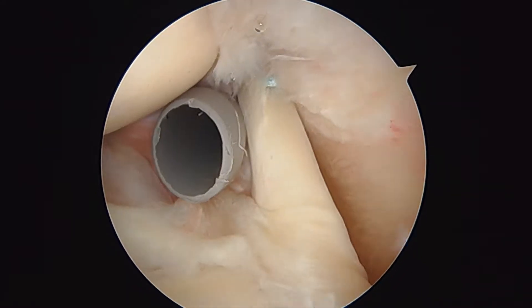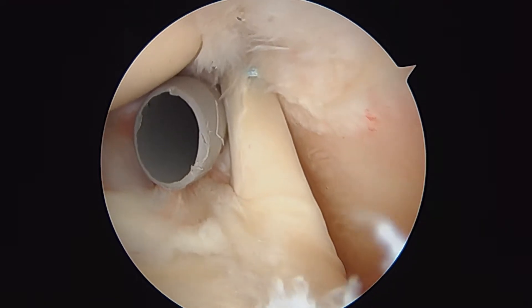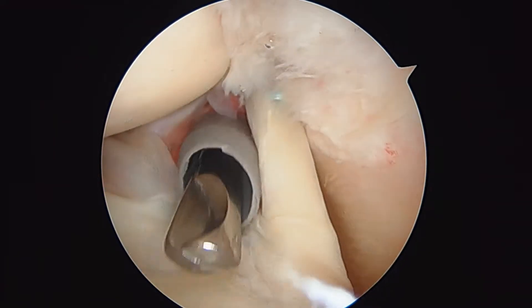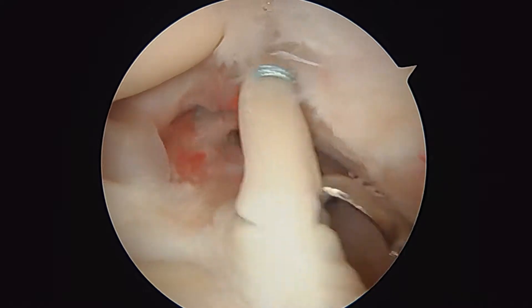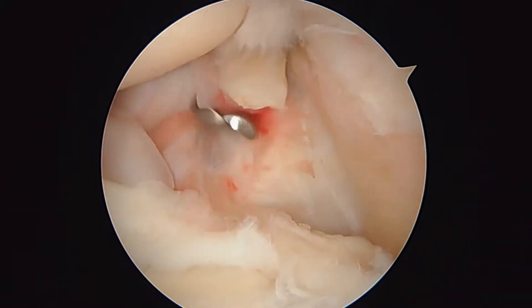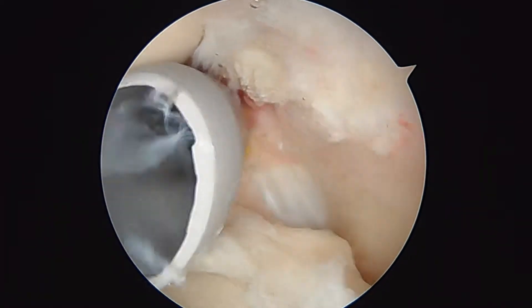Next we'll take a pair of arthroscopic scissors and go ahead and cut the biceps at its base here — just like that. Now the next step is to pass a hi-fi suture across this rotator cuff tear.